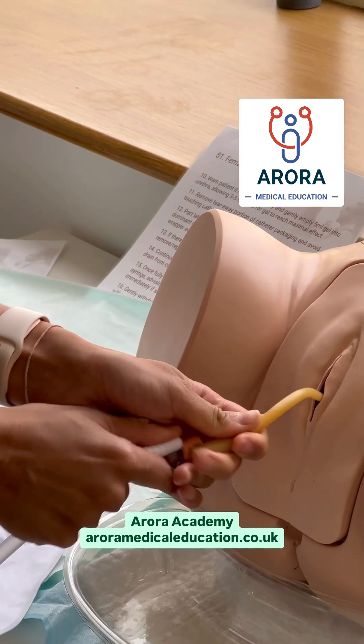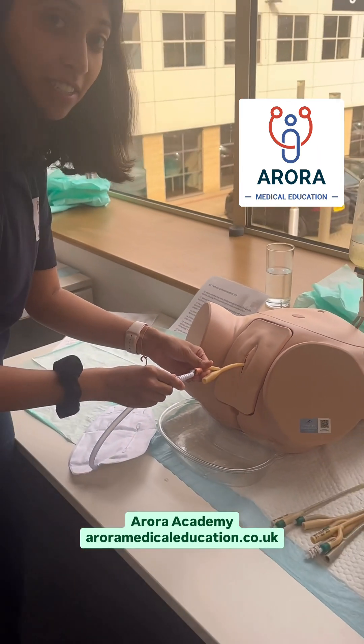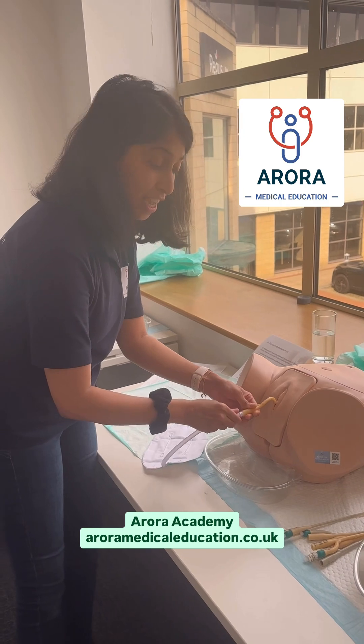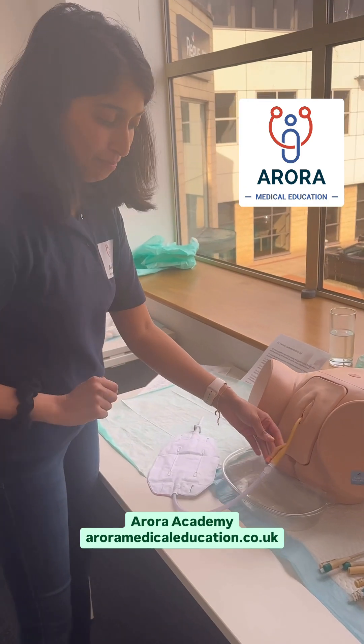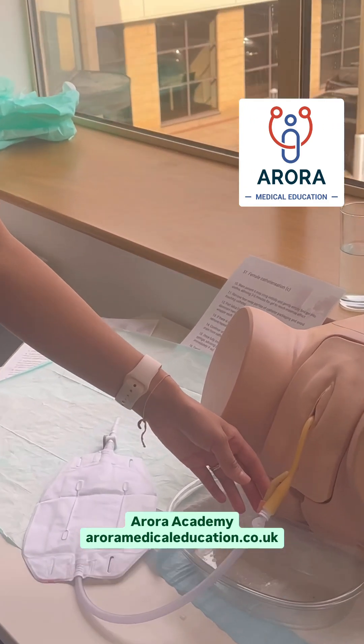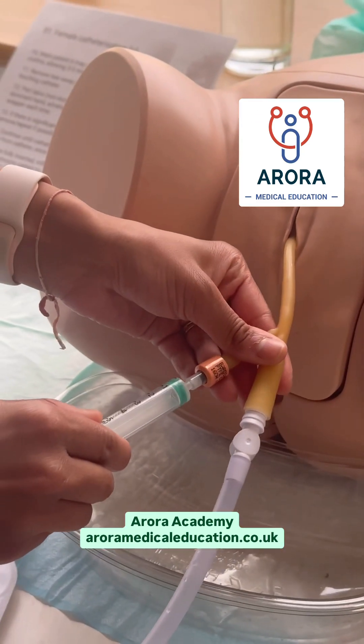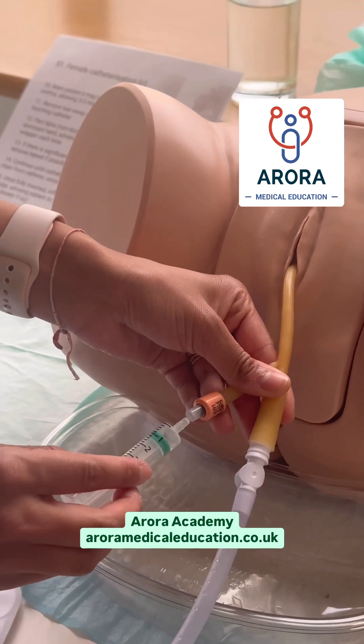If you try the other way round, as you can see it's not going to fit into that syringe hole. So it fits in here really nice and snug and you're in. Even if you get stressed and you forget which one is which, don't forget you cannot get the bag in the syringe hole and the syringe does not fit nicely in the other one.